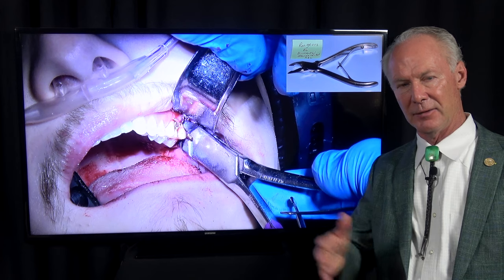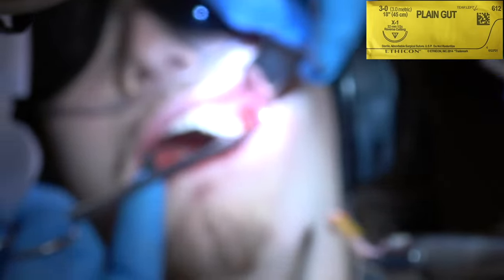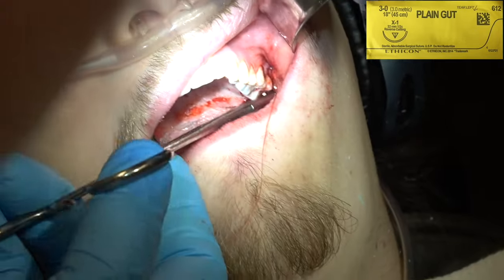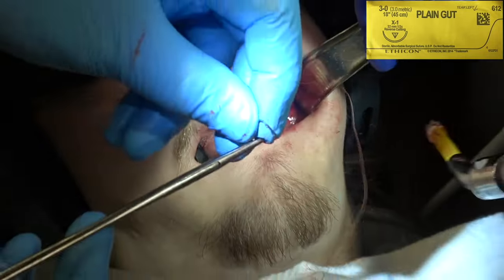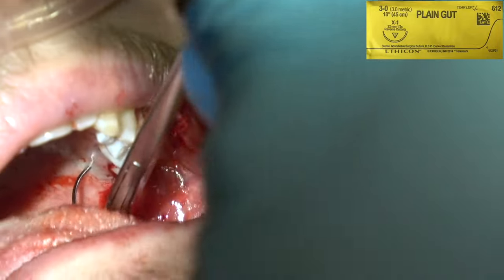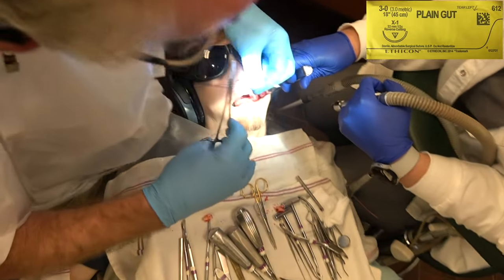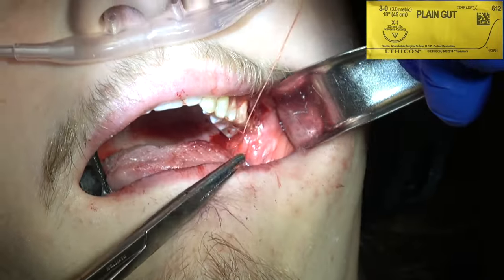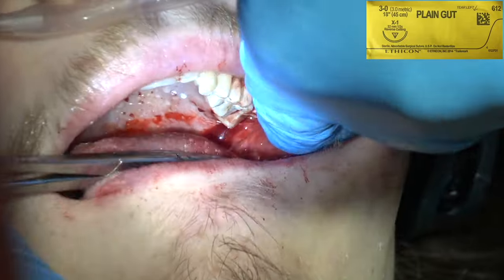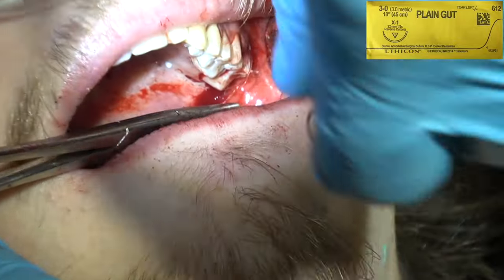When I was in my surgery fellowship for two years at Baylor Dental School, the thought was you take out impacted wisdom teeth up to the age of 35 — past 35, you just watch them radiographically. This young man was about 20. I'm removing the follicular sac and suturing with 3-0 gut suture. Remember, these surgical videos are not meant to teach somebody from scratch how to do surgery. If you're doing surgery without significant surgical background, you need hands-on training. These videos are to enhance your technique if you've already got that hands-on training.